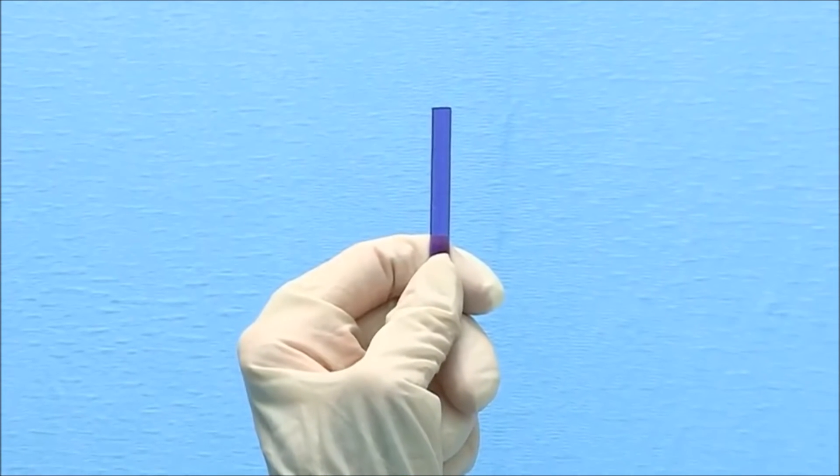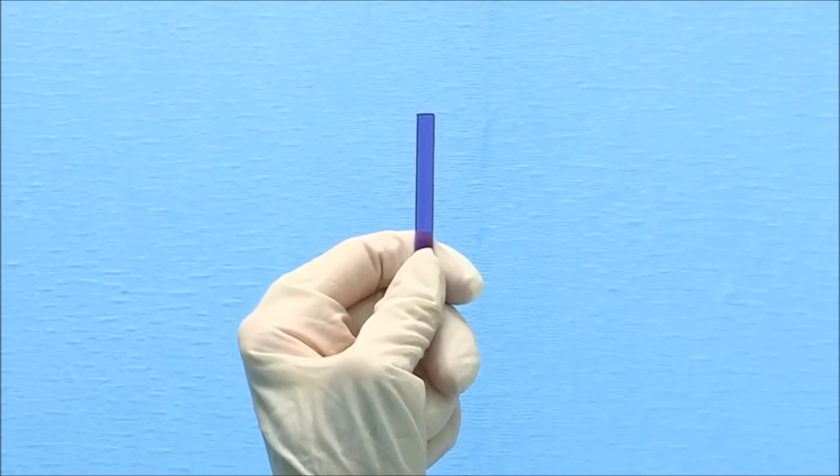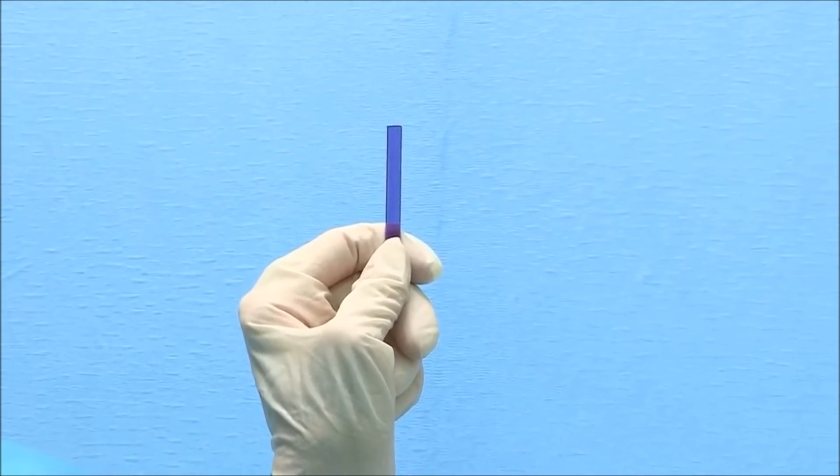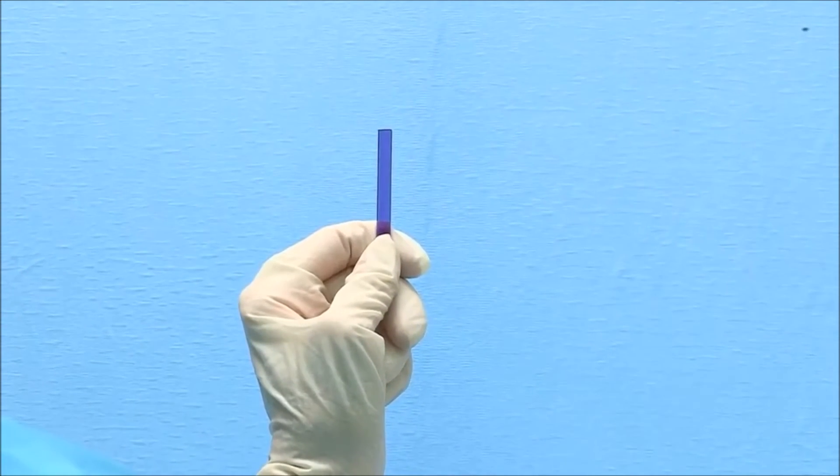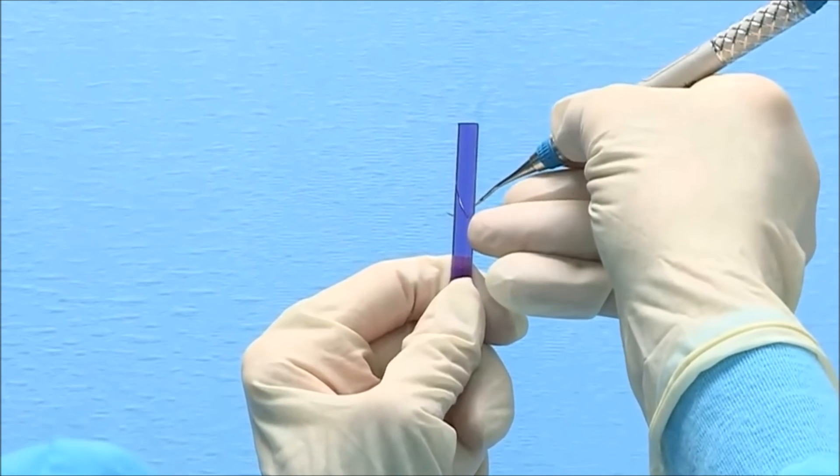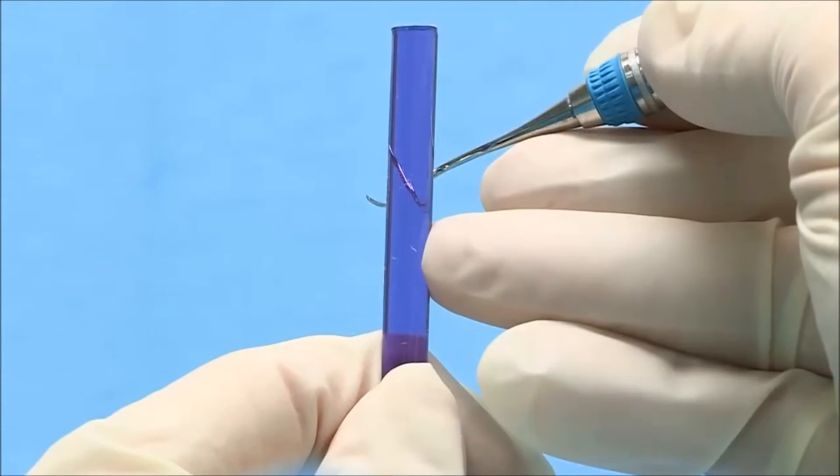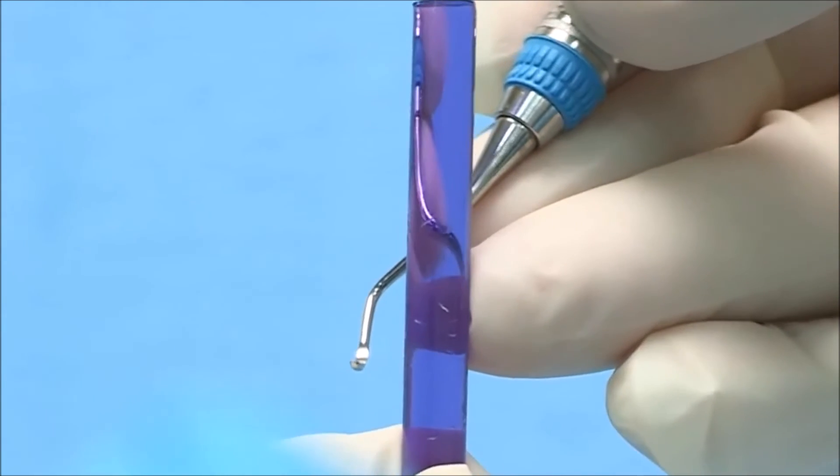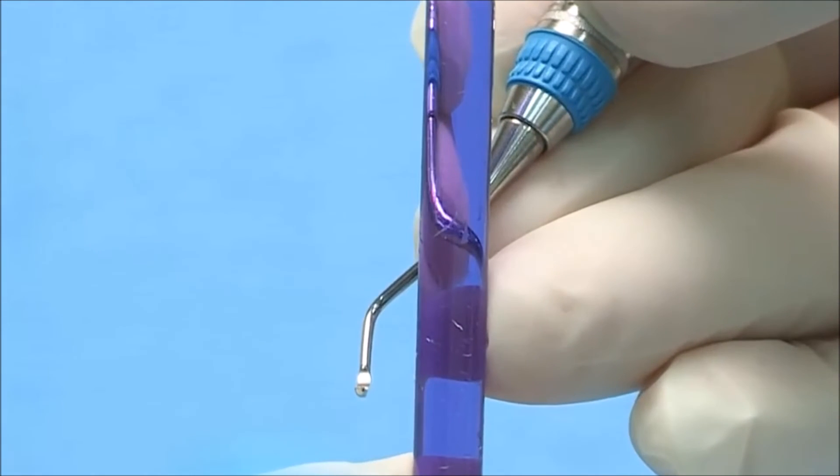To test the cutting edge, hold a plastic test stick in your non-dominant hand between your thumb and index finger near the bottom of the stick. Hold the test stick upright at 12 o'clock. Hold the instrument in your dominant hand with a modified pen grasp. Place your fulcrum on the right side of the test stick near the middle of the stick. Bring the instrument around the back of the test stick with the toe pointed toward you.